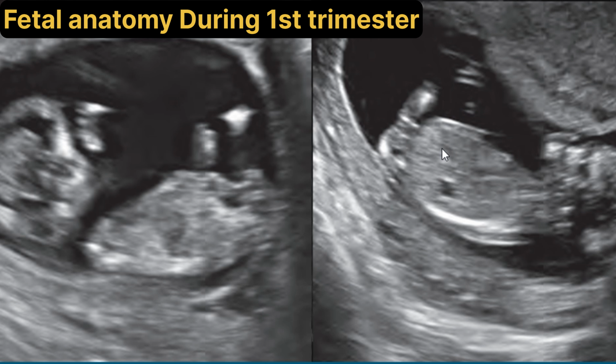This is the left parasagittal image, and here we can see the head of the fetus, and this one is the spine, but here we can see another anechoic structure that is the stomach bubble that is visualized on the left parasagittal plane in the left upper quadrant.